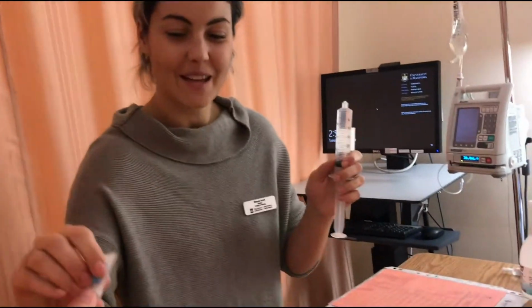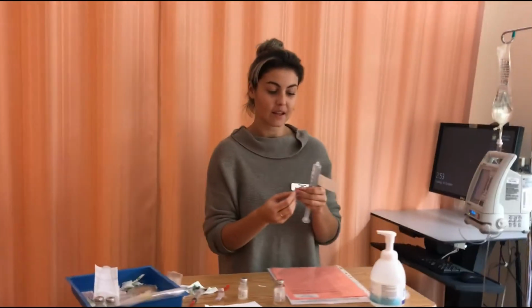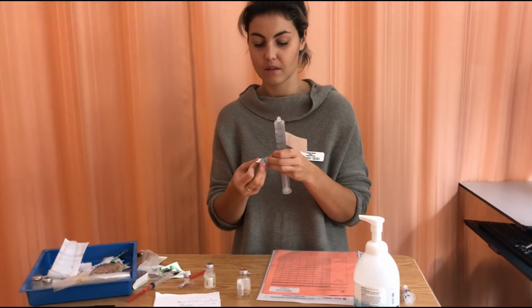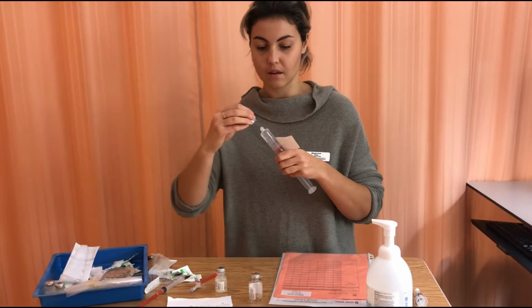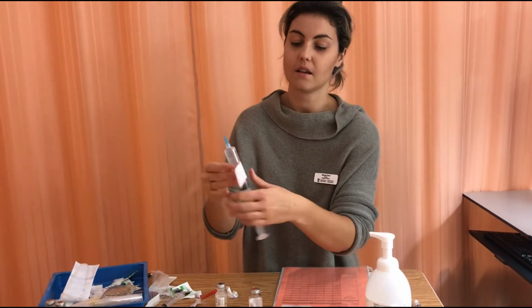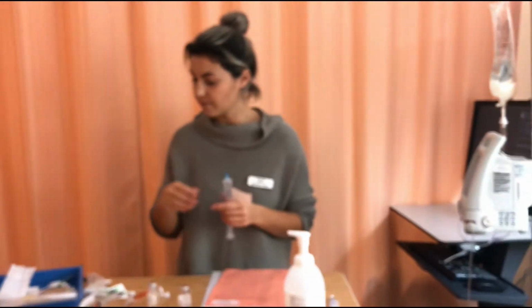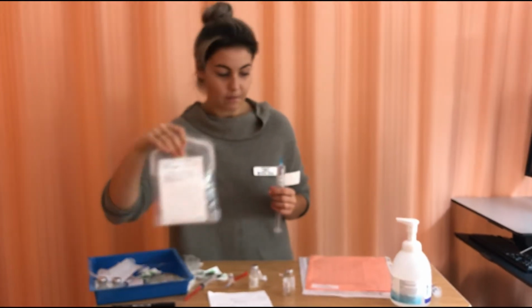So I just had a nurse pass me a new blue cap, and in the meantime I put my label on my medication. And just look at my label. Okay, and then I'll be moving to the bedside.